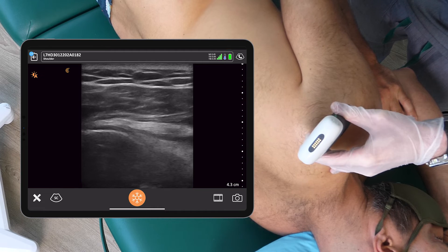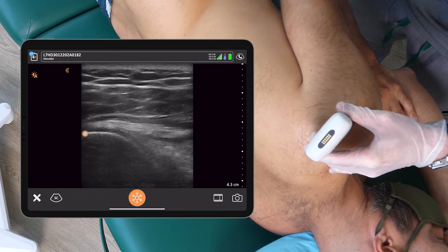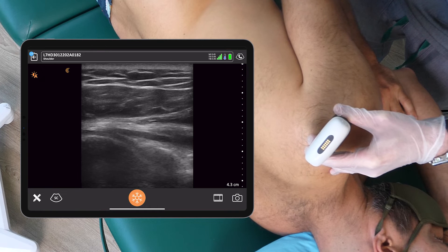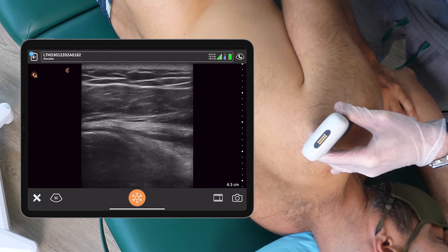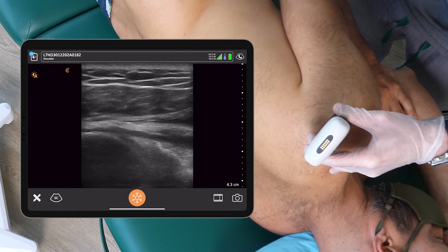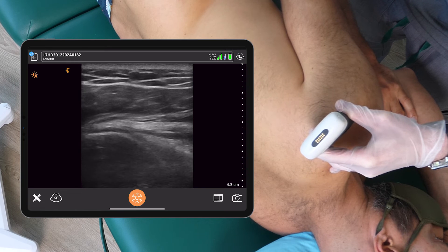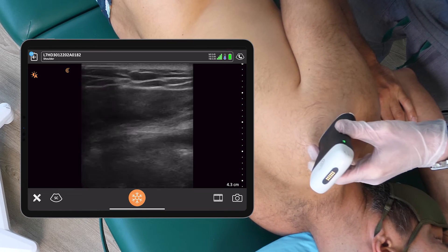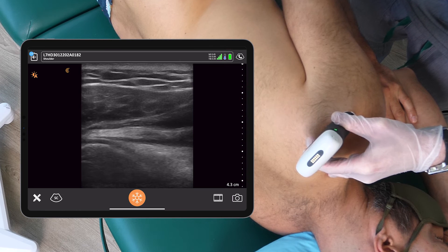Let's take a look at the tissue. Here we have an image of the posterior glenohumeral joint. We can see the curvature of the posterior humeral head, and we can even see the labral tissue. We'll be inserting the needle in between the posterior humeral head on the medial aspect and the labrum. I don't see any issues in terms of vascularization on the way to the injection, and this looks like an optimized image to have a successful injection.